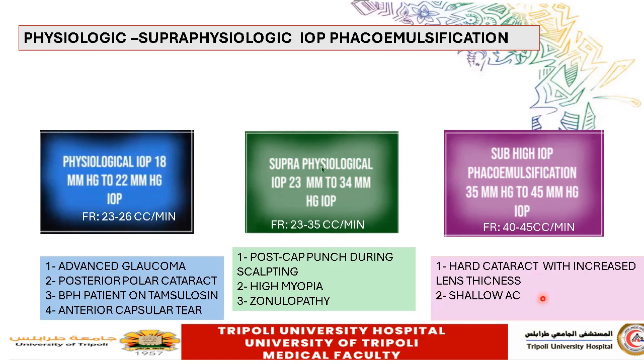So the setting of a target intraoperative pressure is now possible thanks to the advancement in phacoemulsification technology and the innovation of the Active Sentry handpiece, which moment by moment monitors the changes in the intraoperative pressure, and accordingly injects pressurized irrigating fluid to facilitate the operation. So this possibility is now available by the innovation of a new phaco technology.